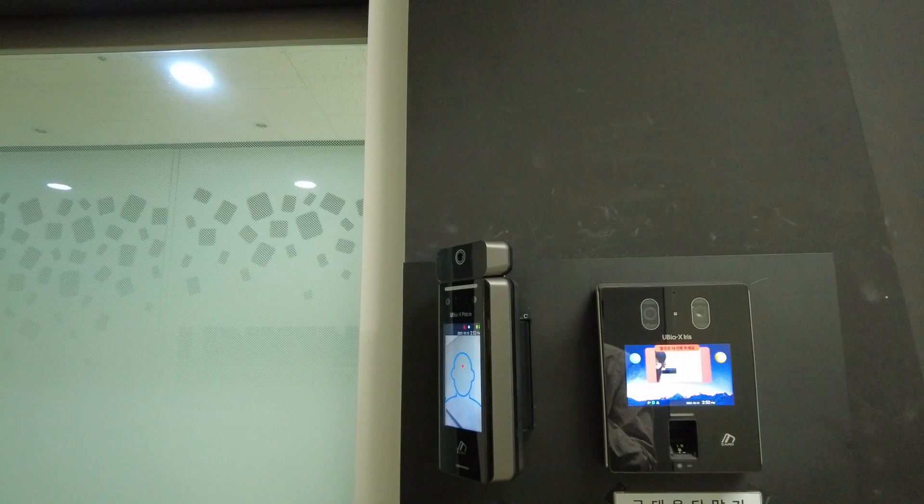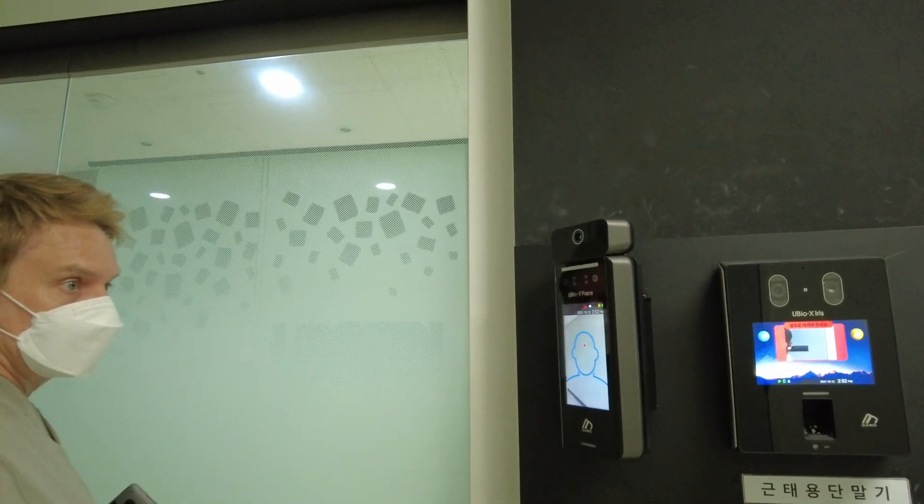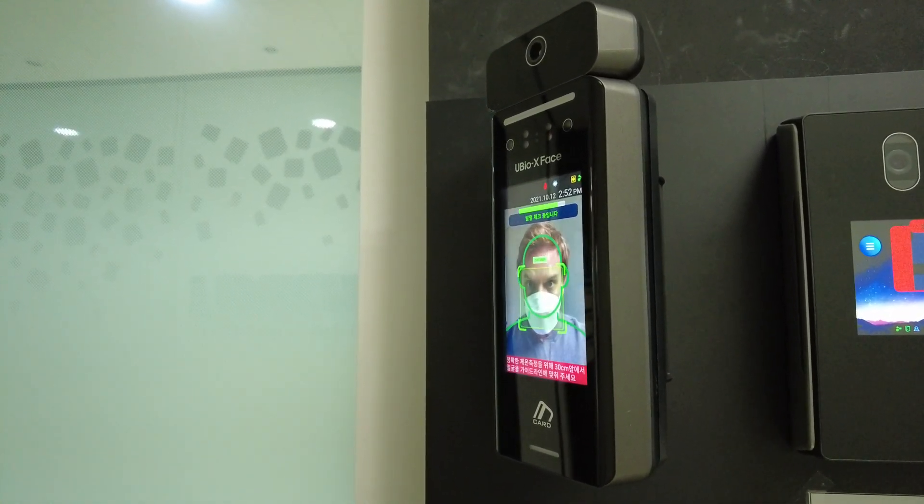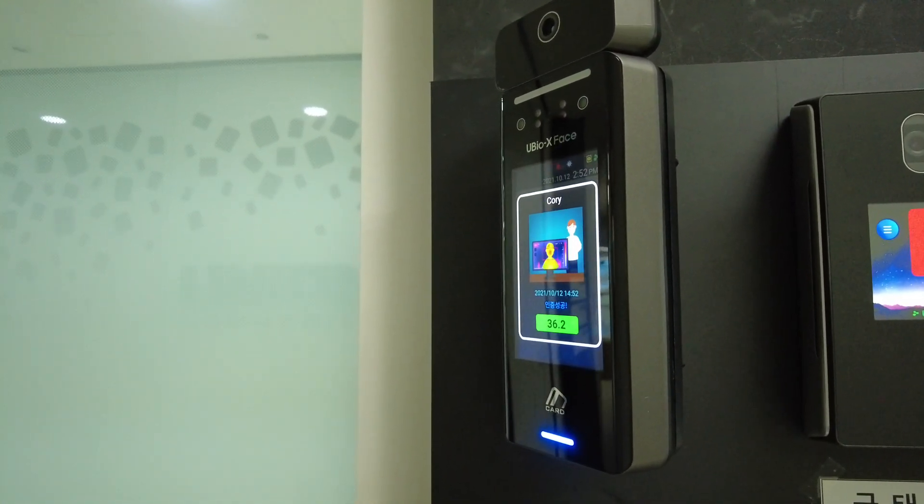It's not going to detect me of course. I have to take my temperature in the precise area, and it's going to read accurately.